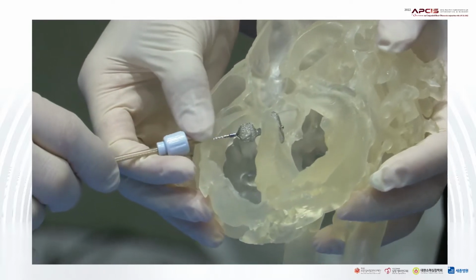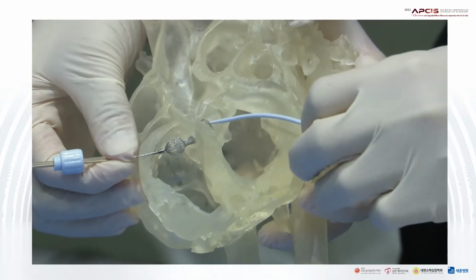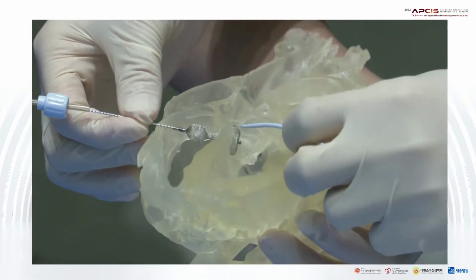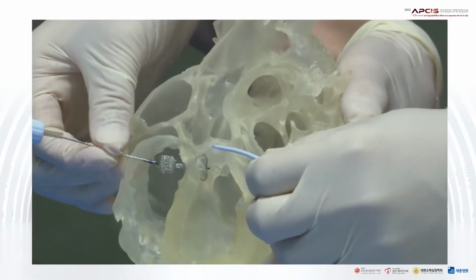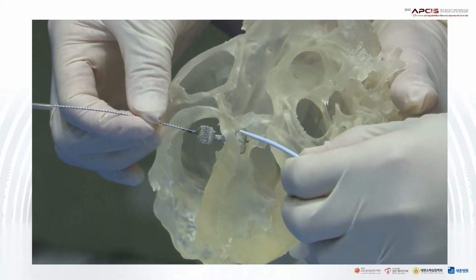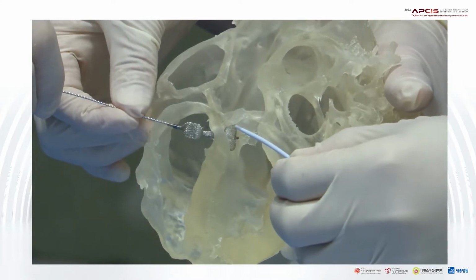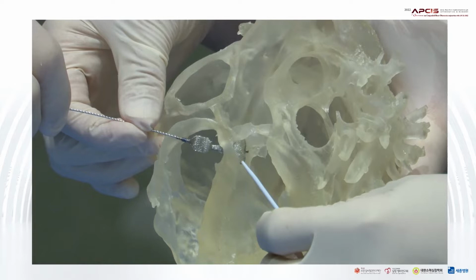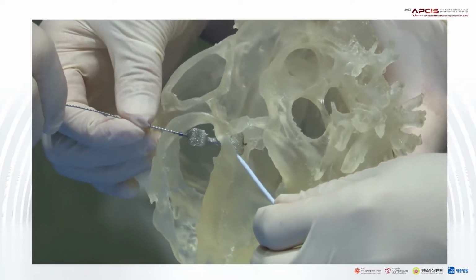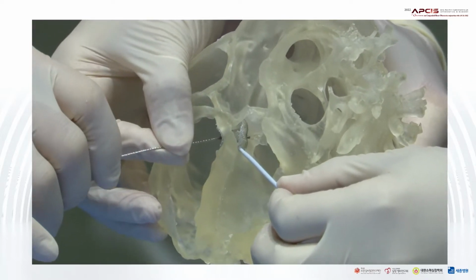Which is on the left side. This is not a perfect device in relation to this defect, but just to share with you that if there's no distance between the defect and the aortic valve, the device may touch the aortic valve and may cause aortic valve injury. Also the disc on the left side may touch the conduction system and cause a heart block or left bundle branch block. Okay? And on the right side, like that.